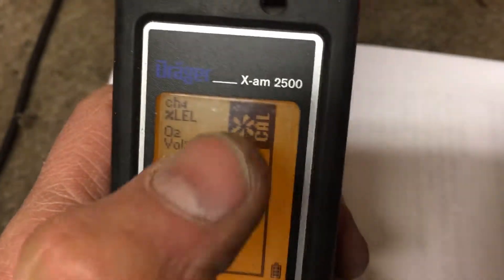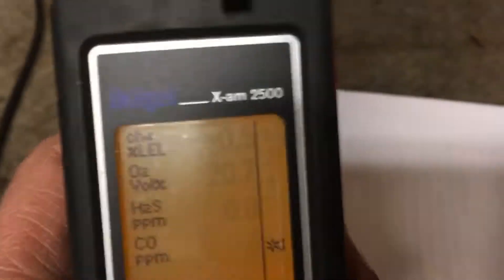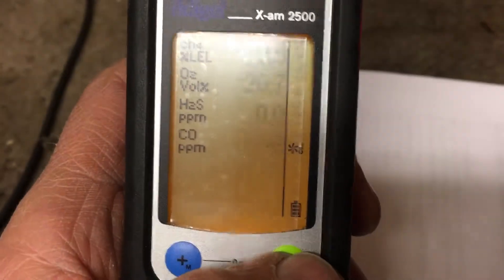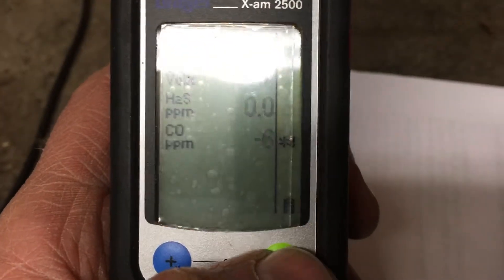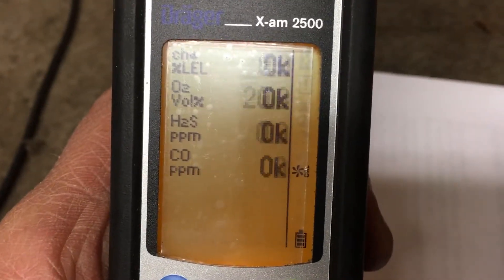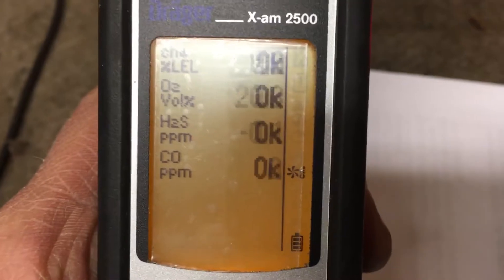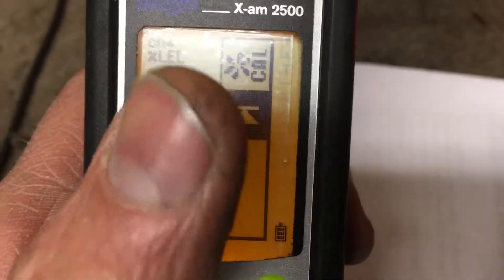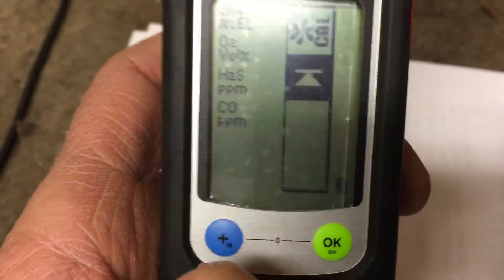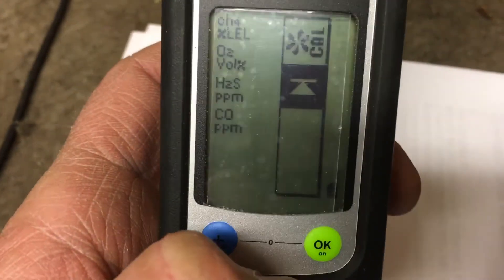You get the fresh air cal symbol. Push the green button once — it goes through the system to perform the fresh air cal. Push the green button one more time, and everything comes back okay. You get the cal symbol and can just leave it.